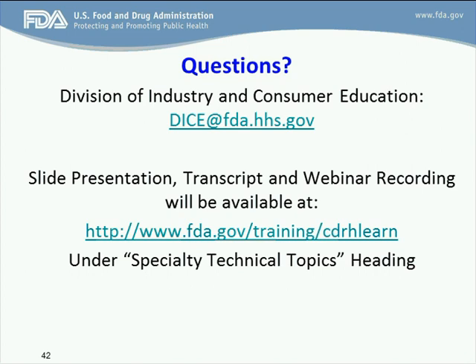Hi, this is Steve Elliott. With regards to that, the intention behind that language is to ensure that the validations are going to be consistent with FDA-cleared cycles and accessories. If appropriate, it could be acceptable to use biological indicators that have not been FDA cleared, particularly if the resistance characteristics are known and appropriate, and the nature of the validation involves something like a direct inoculation or placement on a wire or something like that that wouldn't be possible with a paper BI or SCBI. Okay, great, thank you.